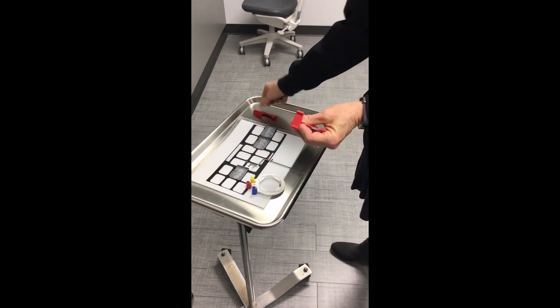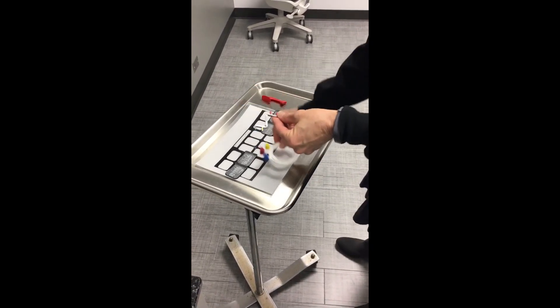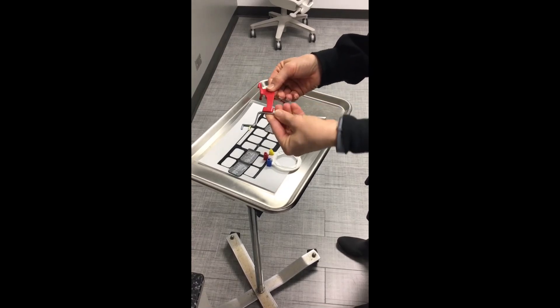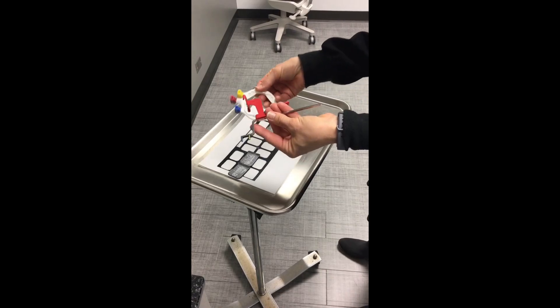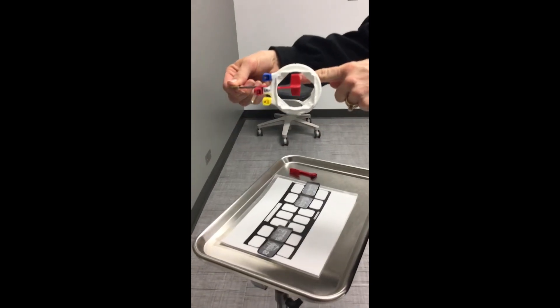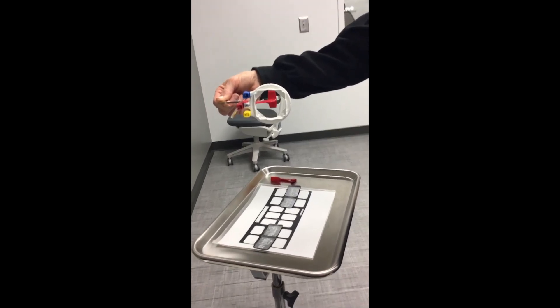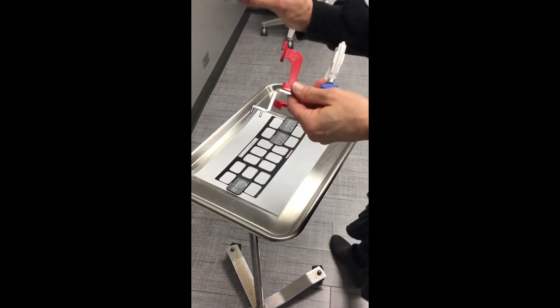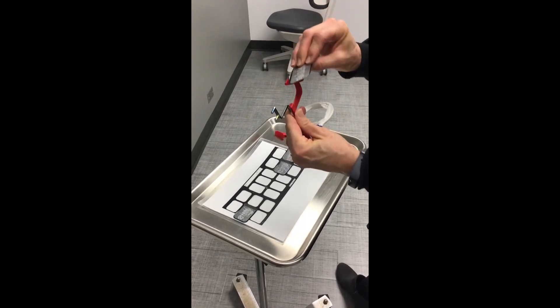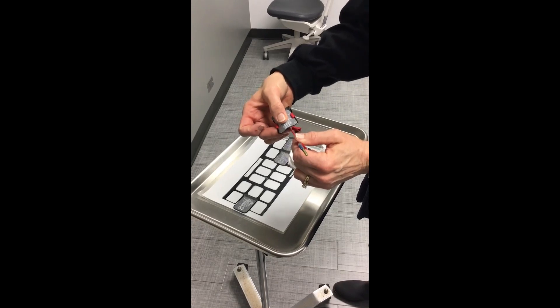Today we're going to be doing horizontal bite wings, using size two PSP plates. Take your arm and attach your bite block to it. Then take your ring and place it on the arm — you should be able to see the entire bite area through your ring, which confirms it's correct. Next, place your PSP plate in the bite block, making sure the black is always toward the ring. Slide it into the bottom and flex it just a little bit to seat it in the bite block.